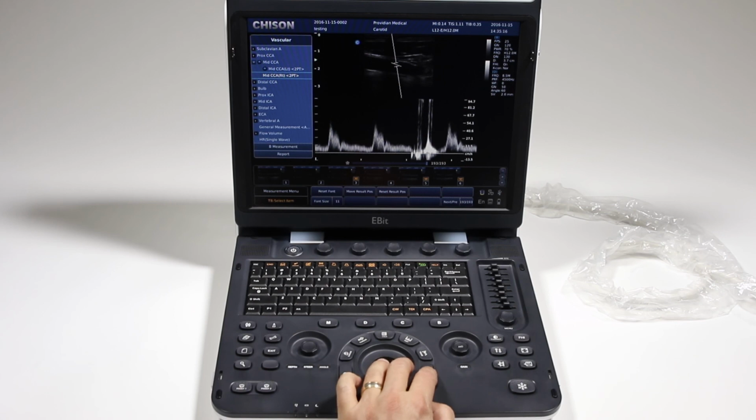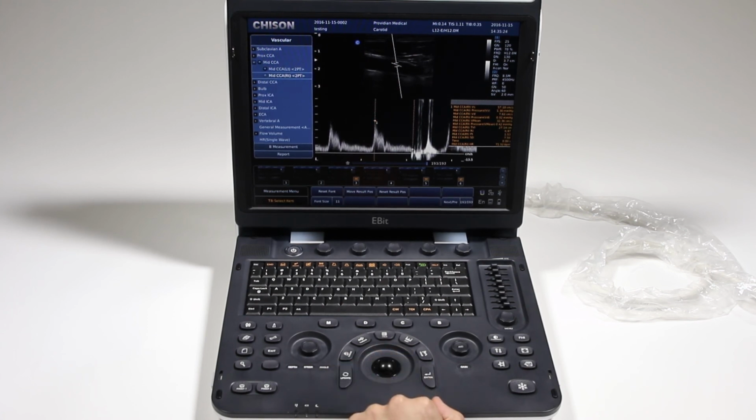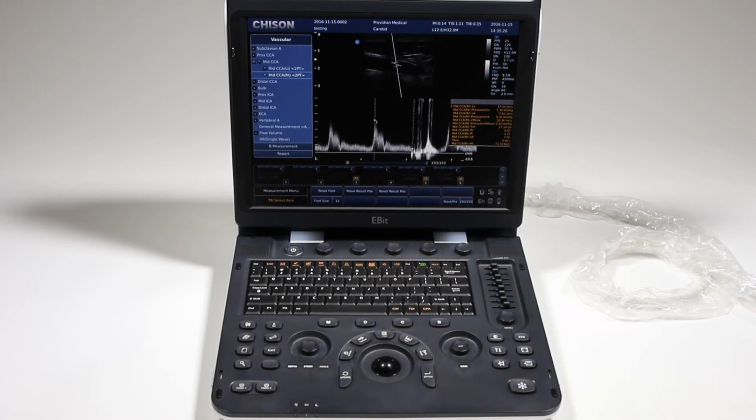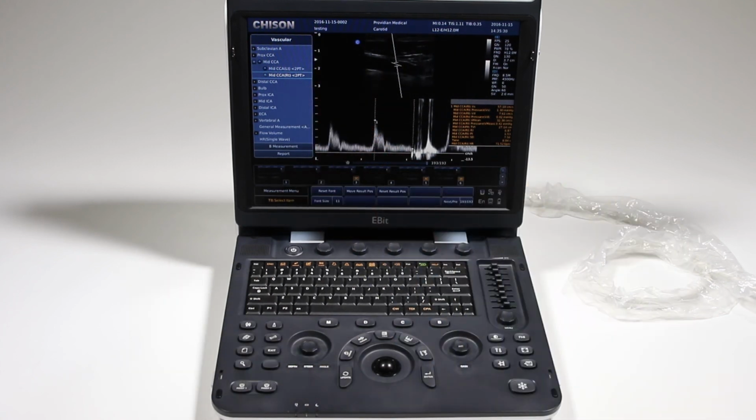So if I want to go ahead and do that, I'm just going to hit the 2 point, get my measurement, and I'm done. So now I get my results box, and we'll address all those issues here, but it will remember this setting as the 2 point measurement. You're only going to have to change that once.